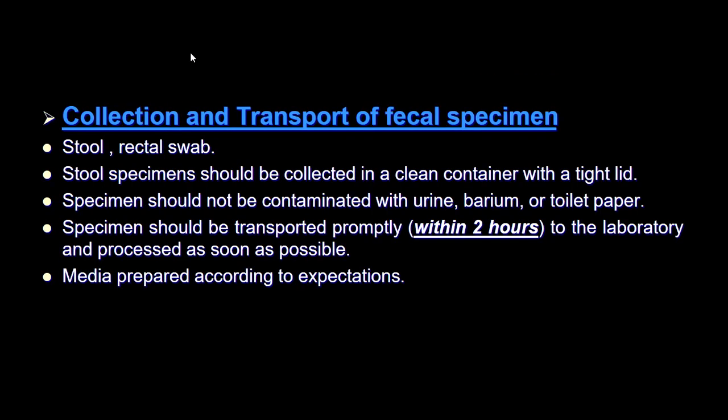In order to make a diagnosis of the infectious agents, whether they cause an invasive type of diarrhea or a non-invasive type of diarrhea, we have to collect a stool specimen, and the collection has to be as soon as possible. The sooner the better, because if we are delayed, then the possibility of contamination is much higher.